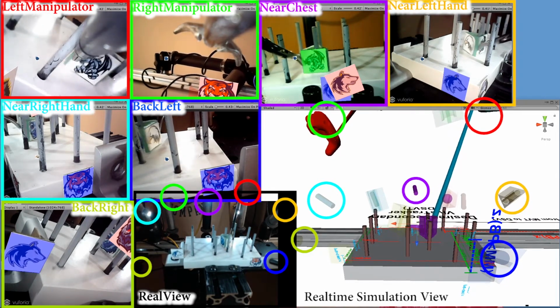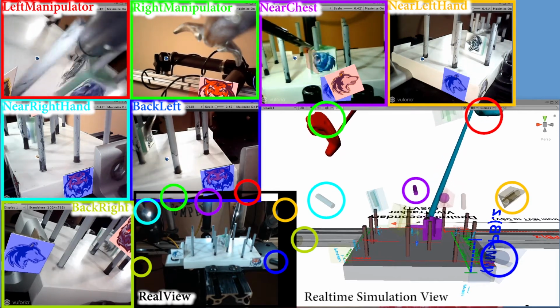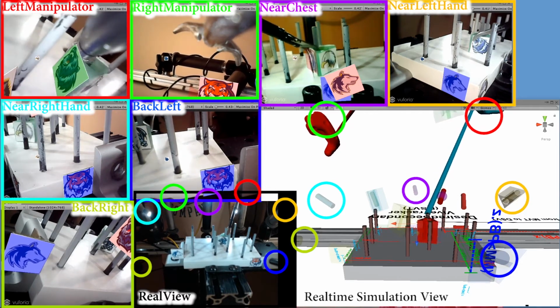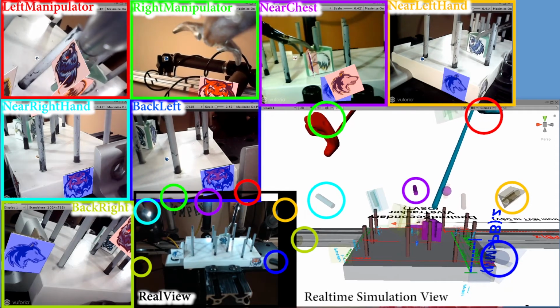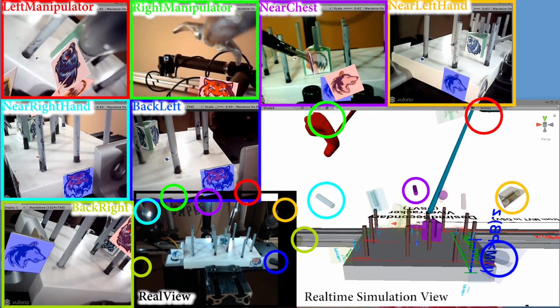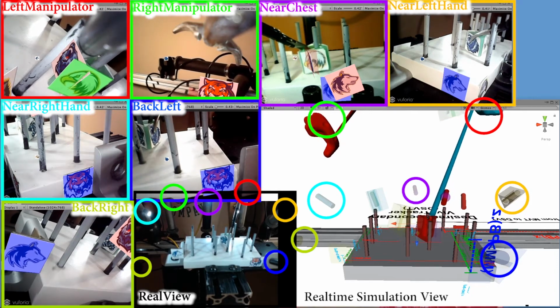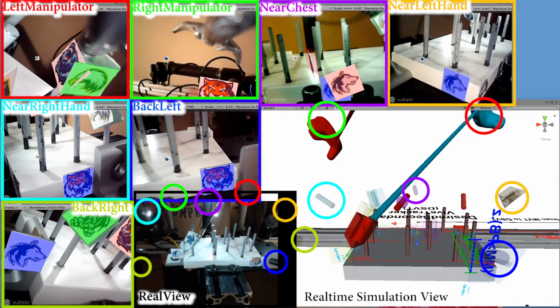You'll also notice a couple of times throughout the video, like here, it's hard to get the manipulator to recognize the donut marker. Like in this case, the left manipulator noticed the bear marker much more easily, and the eagle one much more easily than the dragons. I'm not sure why that is, but this is a pretty big deal and I'll have to solve it eventually. Because the right manipulator actually sees the dragon by far the easiest, but the left one I don't think ever recognized the dragon. So that's definitely something that I'll need to troubleshoot.